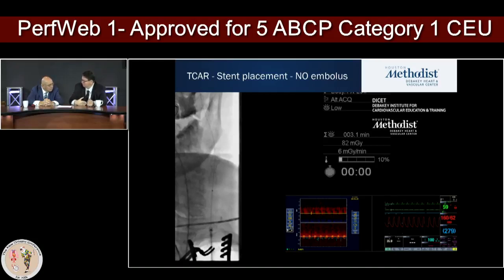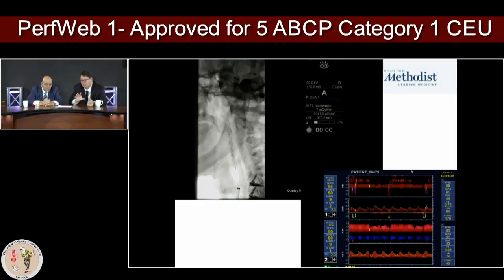Sure, when you're a beginner, even in an open carotid surgery, you have a lot of air. But this is a TCD, a perfect teaching tool for our fellows, so that you can de-air, send everything to the ECA, and protect the ICA. And I think this is where we're learning a lot and able to teach them.